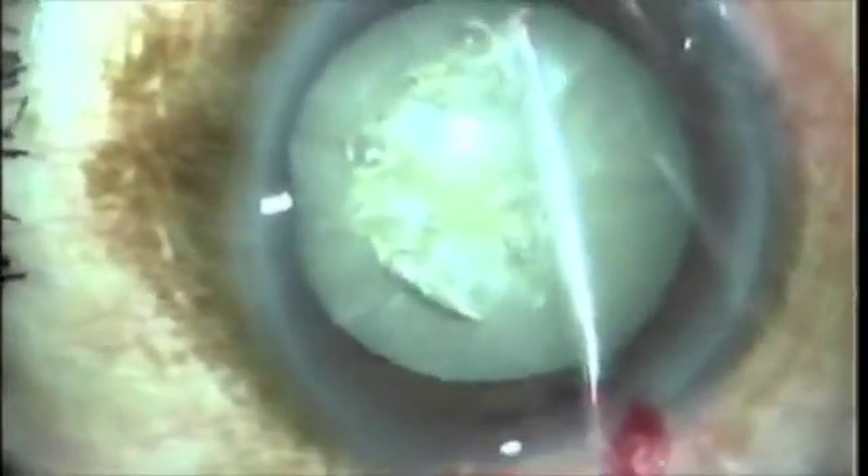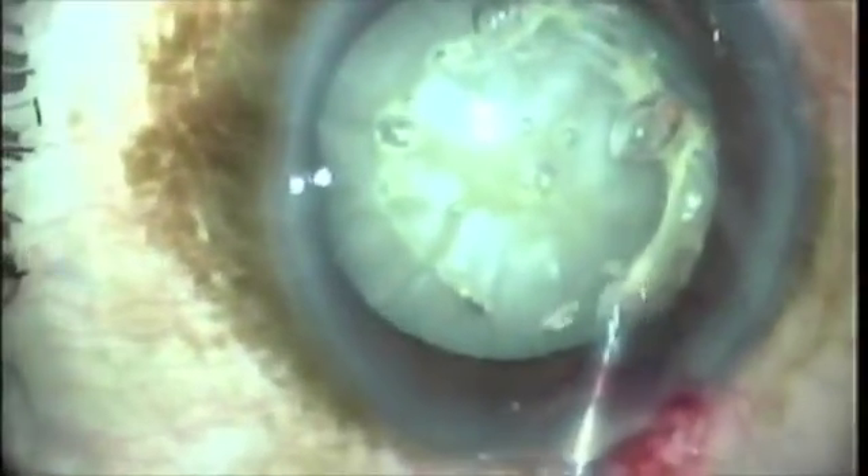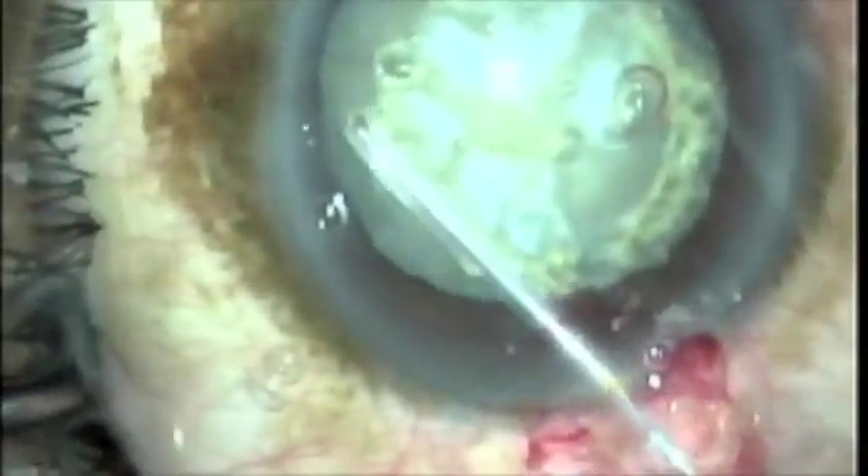This is Dr. Richard Fugo. I'm sitting here in Philadelphia in the middle of a snowstorm, so I have some time to show you some truly fascinating cases — killer cases — that can be managed easily and more effectively with the nanotechnologic capability of Fugo plasma ablation.